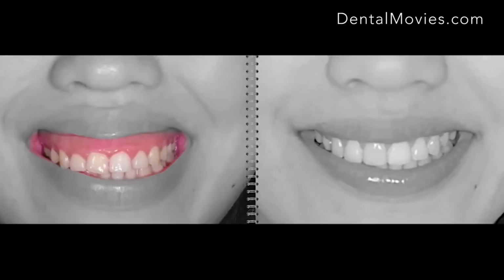They are the same girl, just orthodontic treatment with simple surgical crown lengthening and 4 mini screws, which were produced by Newton. Look at that. Is that great?